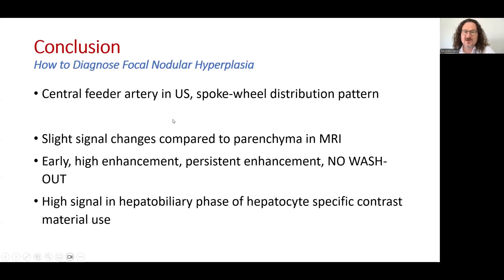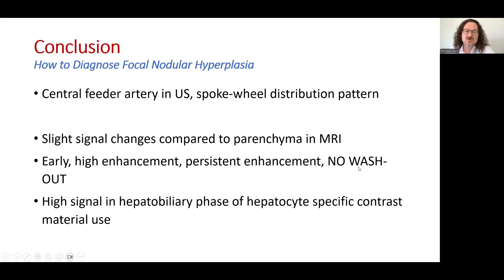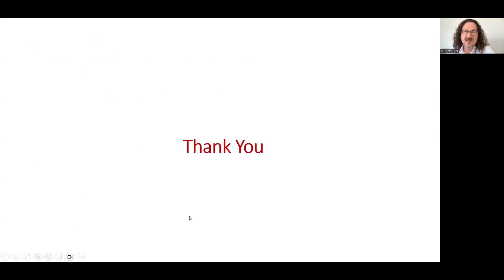In conclusion, the central feeder artery on ultrasound is an important finding to diagnose focal nodular hyperplasia. On MRI, slight signal changes compared to the parenchyma, combined with early high enhancement, persistent enhancement, and no washout are diagnostic findings. Additionally, high signal in the hepatobiliary phase using hepatocyte-specific contrast material is another helpful diagnostic criterion. Thank you for listening.